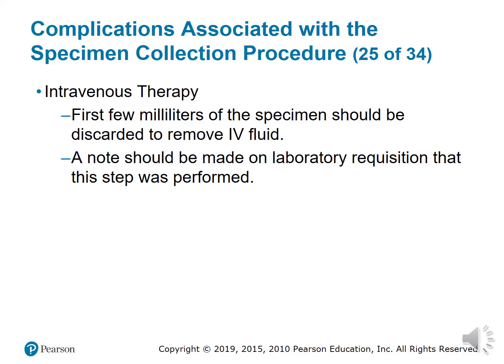A note should be written on the label stating that the labs were collected on the same side as the IV site. This is to let the med techs know, just in case some results come back erroneous.